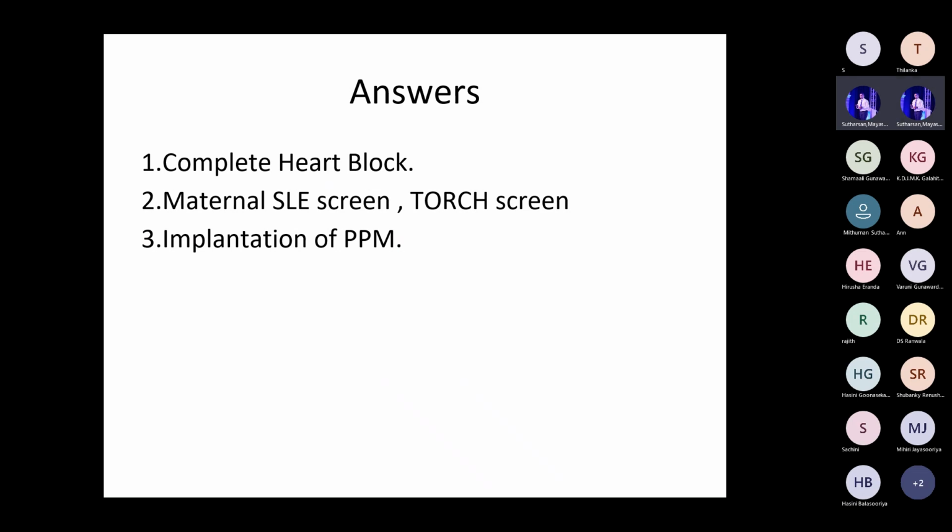So what is the treatment for complete heart block? Yeah, pace, nothing else. Although we don't do it here, in complete heart block there's a very high risk of sudden death. So the treatment is permanent pacemaker implantation. Temporary pacing, TPM, is a temporary measure as bridging therapy until you organize the PPM. Otherwise, sudden death can occur, because severe bradycardia can develop. Sometimes impulses might not be conducted at all, and sometimes the rates can go very, very low.